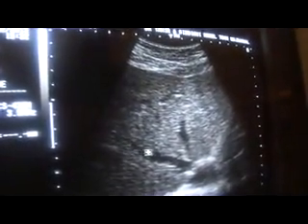This is the status of the liver. The hepatic veins are now dilated and see the blurredness of their margins. Hepatic vein margins are blurred.